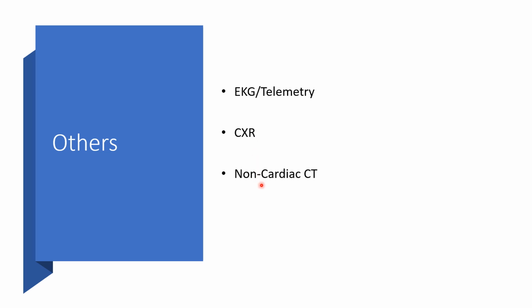Then we have non-cardiac CT of the chest, abdomen, and pelvis, because we might be concerned about metastatic infection, like going to the splenic vascular supply, giving splenic infarction, renal infarction, psoas abscess. Then that will help us to determine the need for a localized drainage.